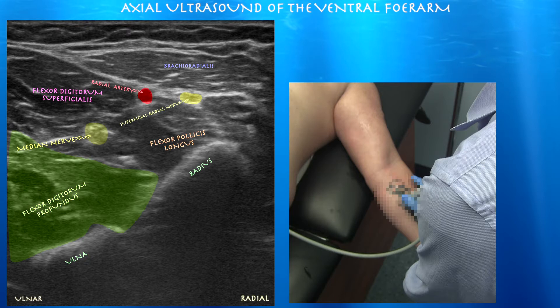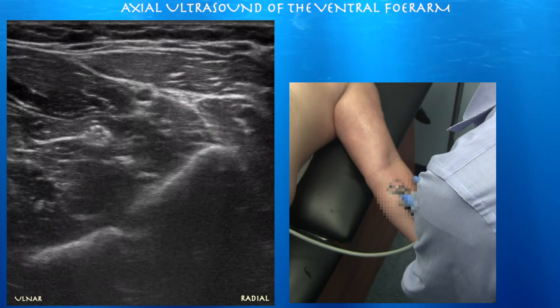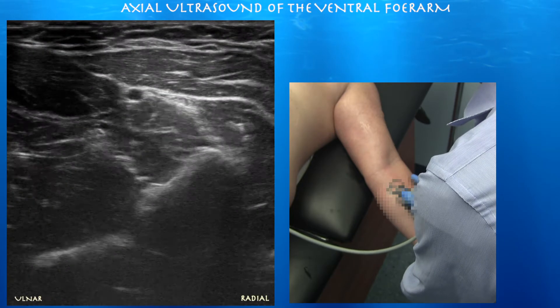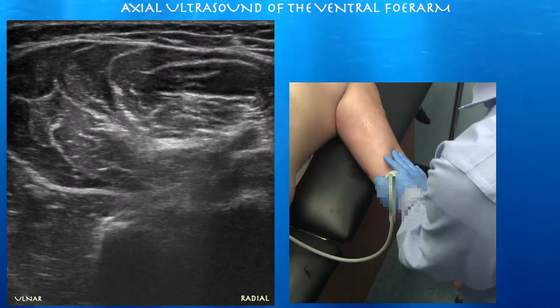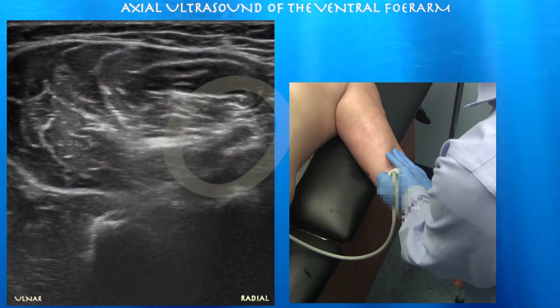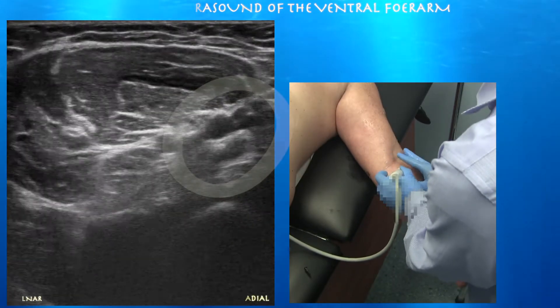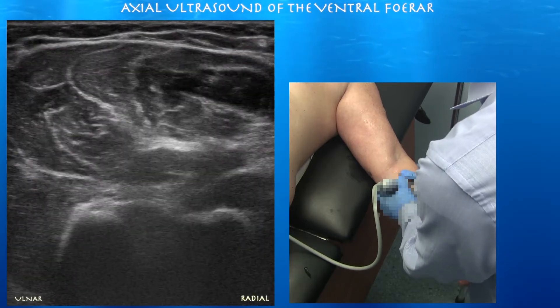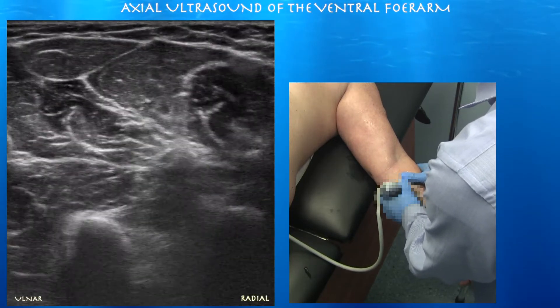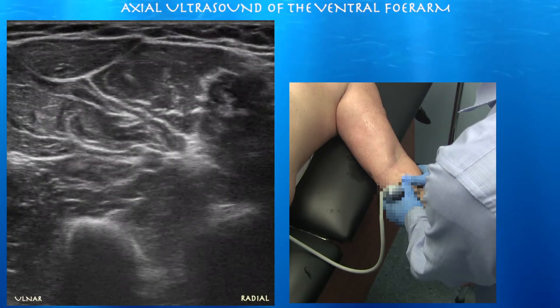And here we are going a little bit distally. You can appreciate those muscles again, also appreciate the radial artery and the superficial radial nerve underneath the brachioradialis muscle. Here we're a little bit proximal and you can see some of the major blood vessels such as the ulnar artery and the radial artery, but at this point it's a little bit hard to tease them out.